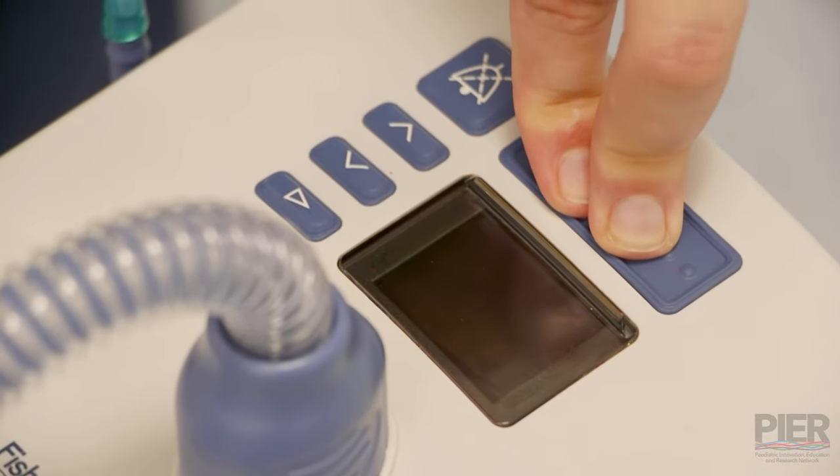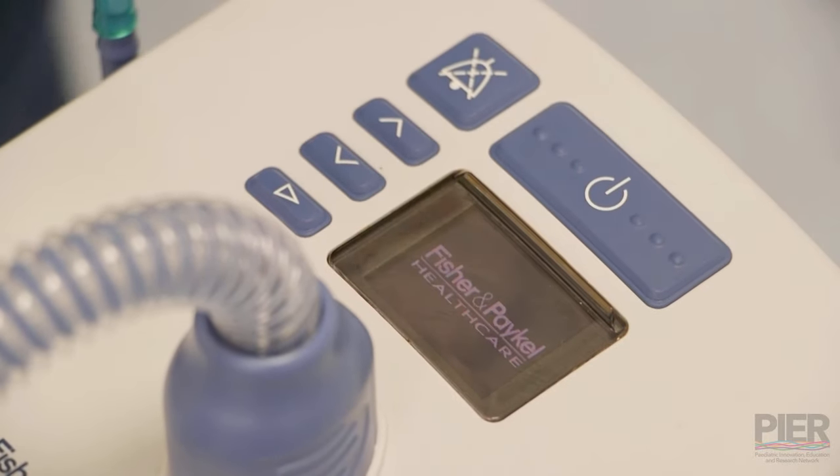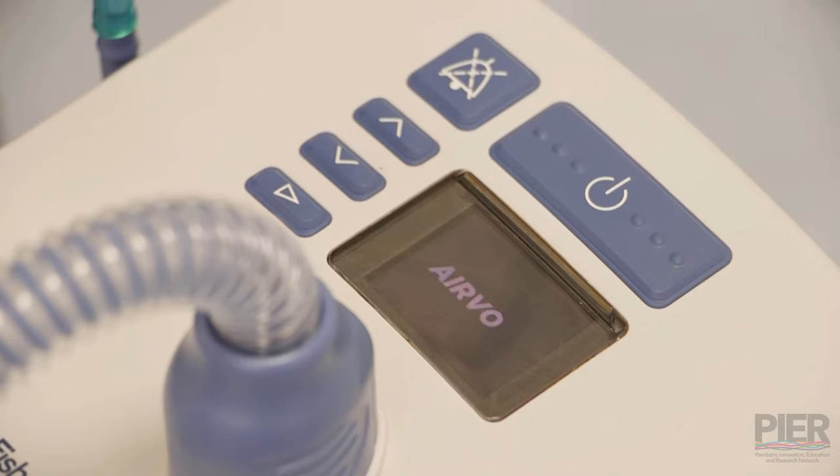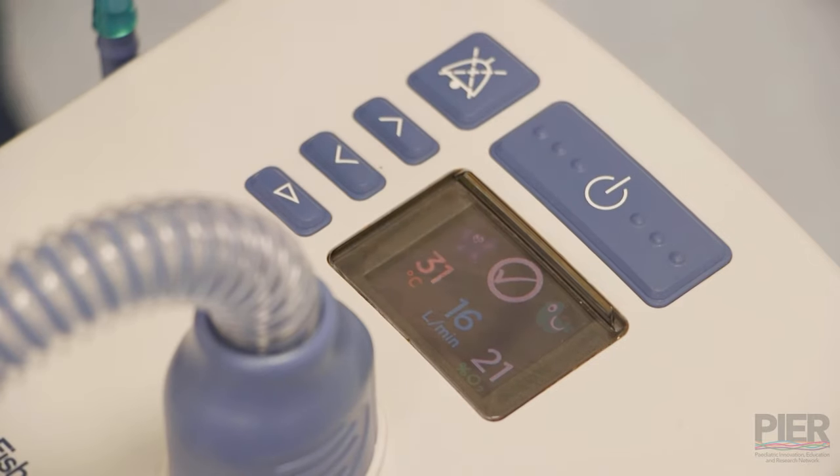So once you've connected up everything, we're going to push and power up the button to turn that machine on. It's going to run through a set of self checks and come through to a traffic light. What you want to make sure is that the traffic light is green. That means the machine has been cleaned between patients and is ready for use. So once that noise has gone and you've got a tick, then you're ready to set the machine for what you want for your patient.